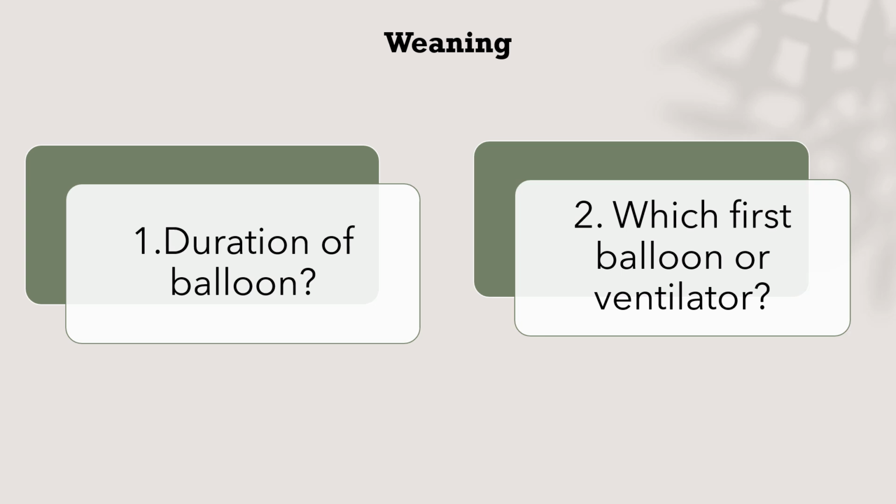But if we extubate the patient and keep the balloon, we should know very well that the patient is not delirious and understands his condition, because with a delirious, agitated patient and the balloon in the femoral artery, there is a high risk of disconnection or decannulation. So we should first assess the patient for that.